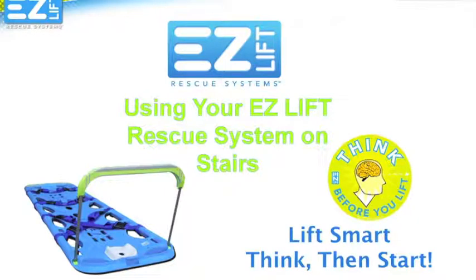Welcome to the EasyLift Rescue System's how-to guide for using your system to carry patients up or down stairs. The purpose of this brief tutorial is to provide you with some basic training and tips that will help you reduce back injuries in your department by guiding you to better techniques for moving patients when it is required.